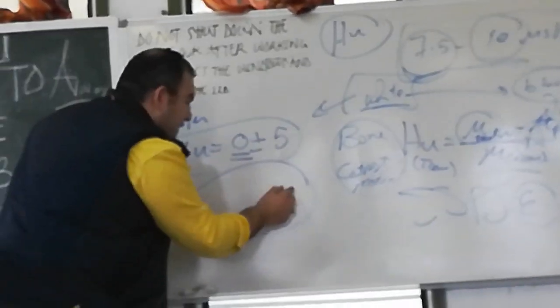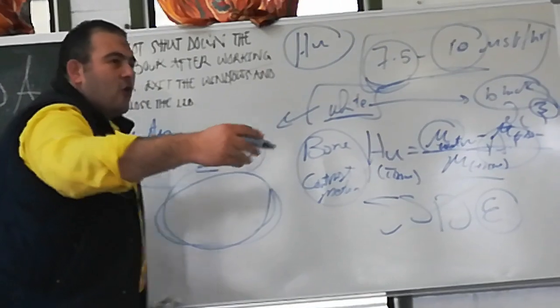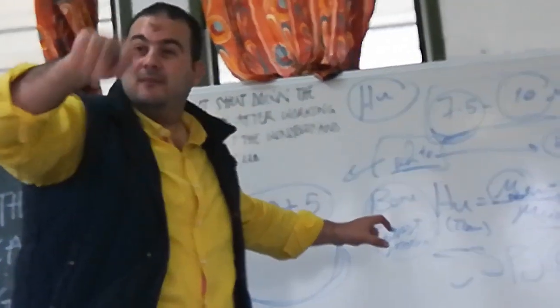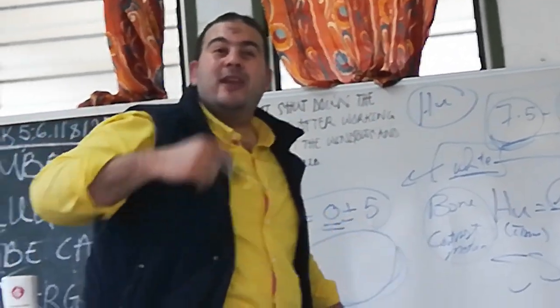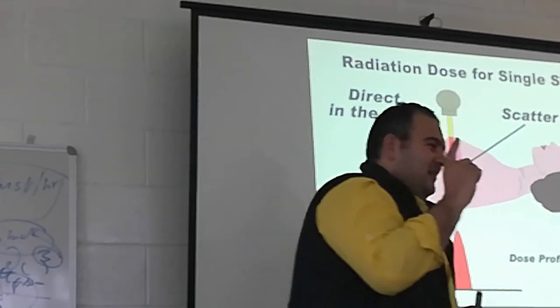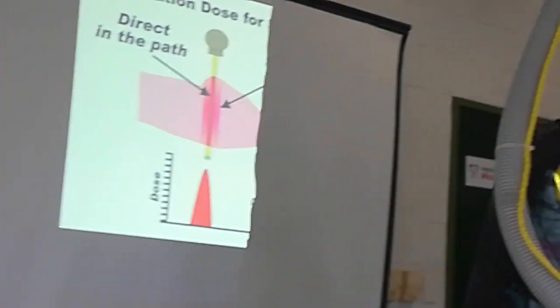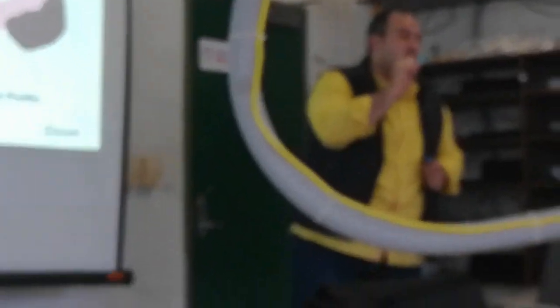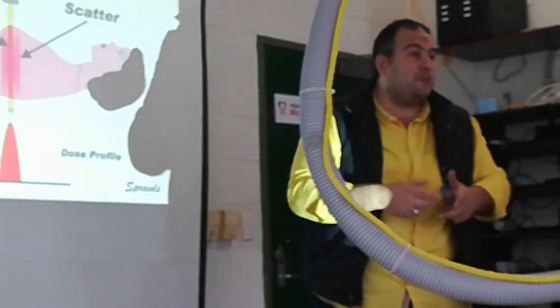Using the image, this is the image of CT, like brain or abdomen, okay? Through calculation of the diameter of the patient, we can get the effective diameter. This effective diameter is used for calculation of the dose of one slice. So there is no accurate estimation for the patient dose. We only make approximation.